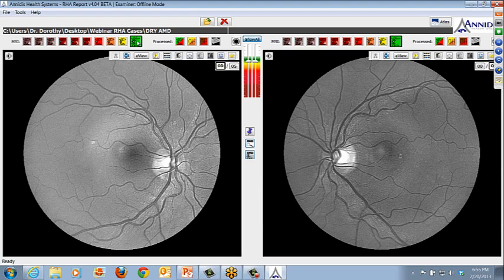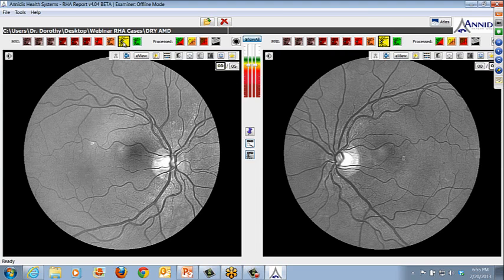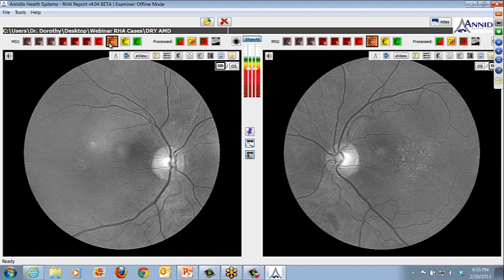So green here, you're primarily seeing reflectance off the internal limiting membrane. Just sub ILM, you're going to start to pick up a nice hyperreflectivity, particularly if there's a healthy nerve fiber layer. And then really amber, you're going to get just underneath the nerve fiber layer. And this is the view that if there's nerve fiber layer dropout, you're most likely to have some visualization of that.